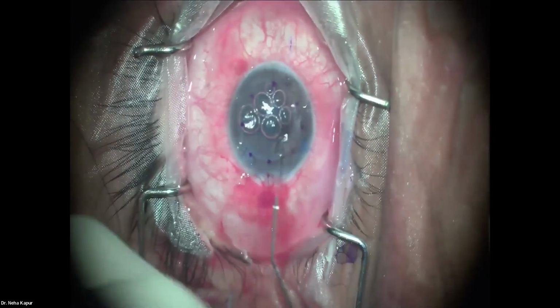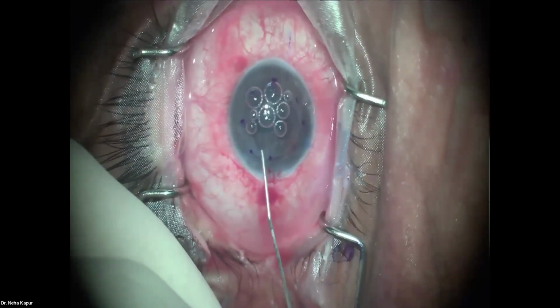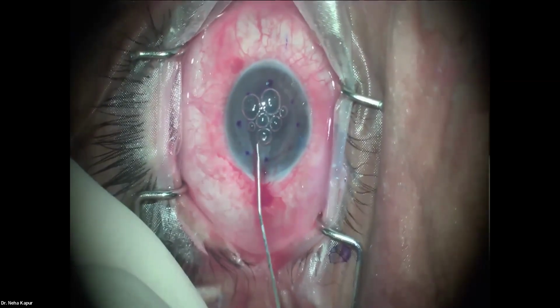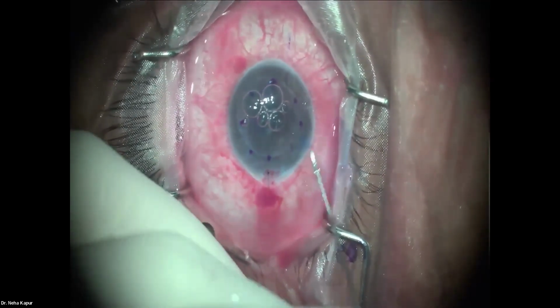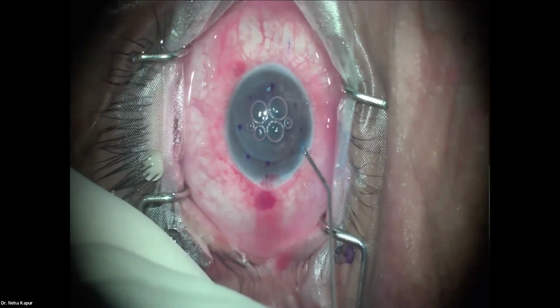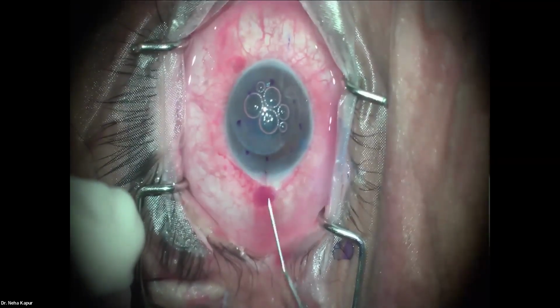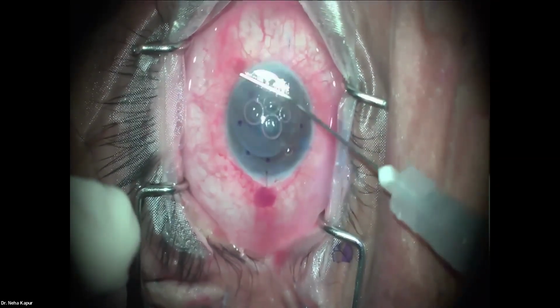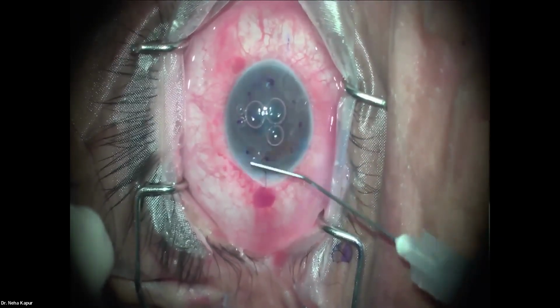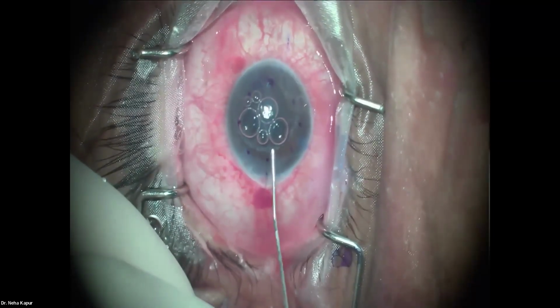So some of the bubbles have gone in the interface, and it's important to recognize this. These bubbles can just be squeegeed out of the interface. Or you can aspirate them and get them out.